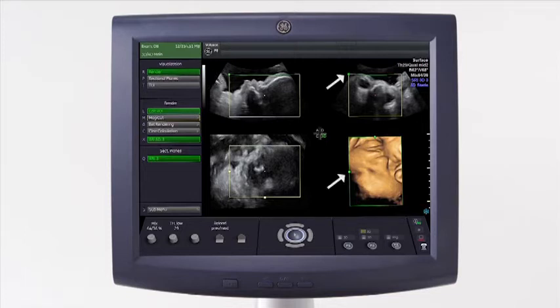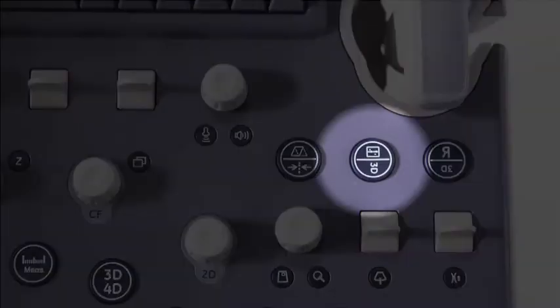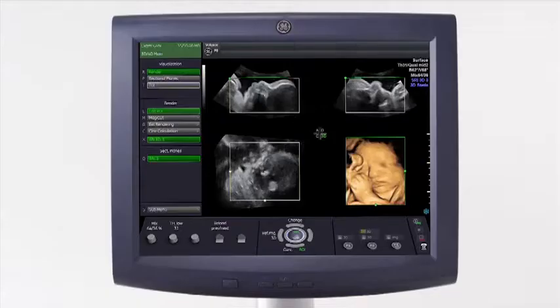The square references the beginning of the acquisition. The square in the B plane is on the same side as the rendered image. The fetus in this example is shown upside down because the fetus is vertex, evident in the A plane. The rendered image can be flipped 180 degrees and the square and diamond move accordingly.